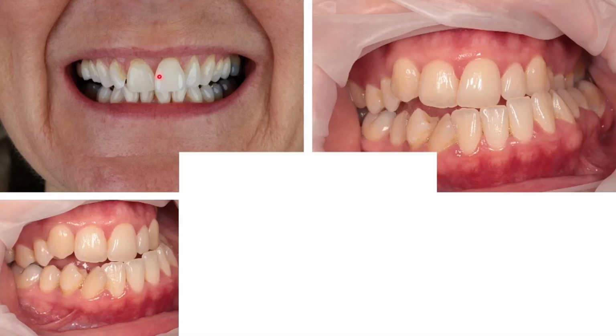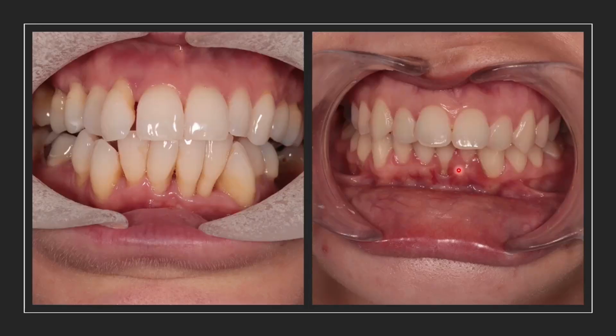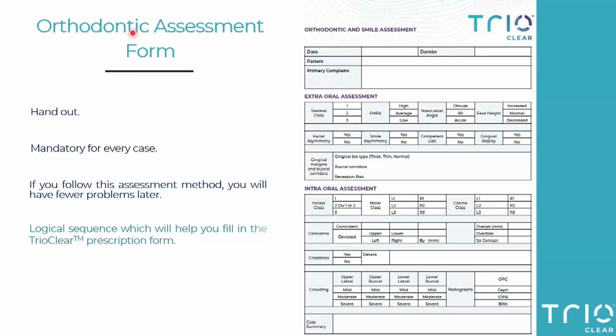Very cautious about overlapping centrals for a specialist orthodontic. There would be a high risk that fenestration became exacerbated from here. I think it's mandatory for every case.